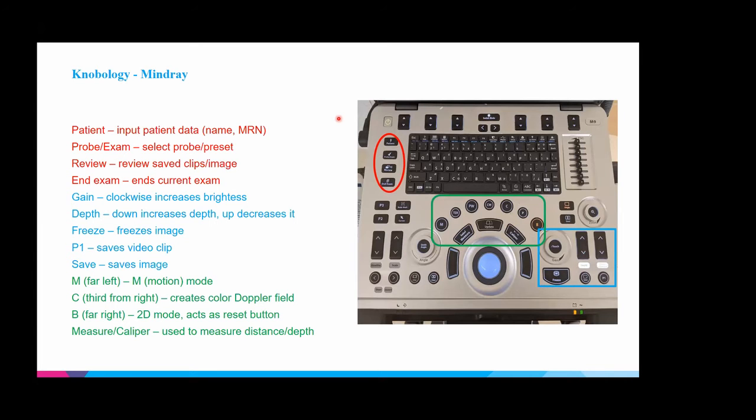And then in the ICU, you may have the fellow or attending or one of you guys may use a different ultrasound machine. So I figured I would just show you guys what some of these same buttons look like on the Mindray. So this is going to be the fancier ultrasound machine, the one that looks like a laptop on a stand. So you have a little bit more tools, but also I think they have a keyboard, so it's a lot easier to type things up as quickly as possible.